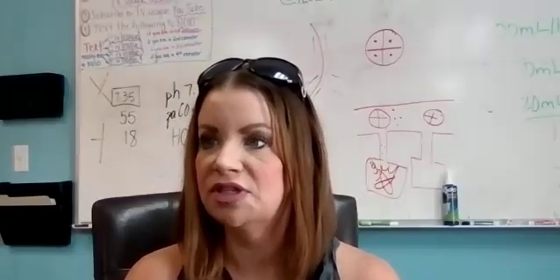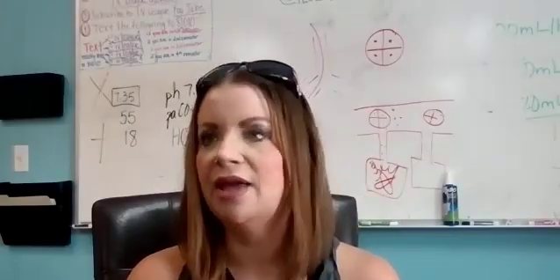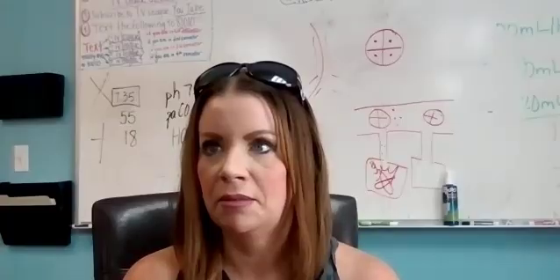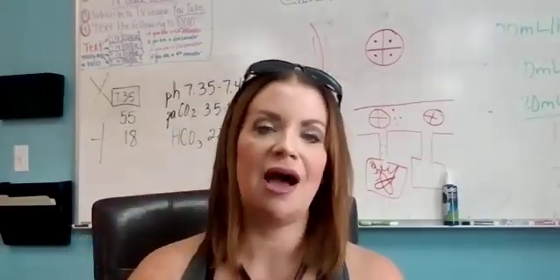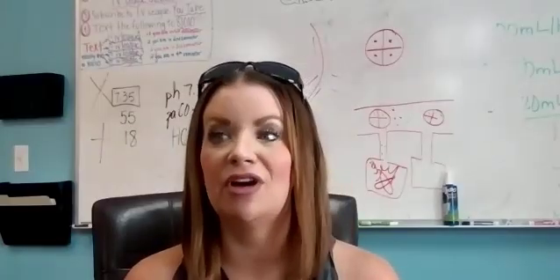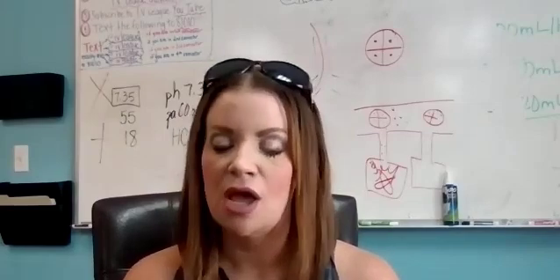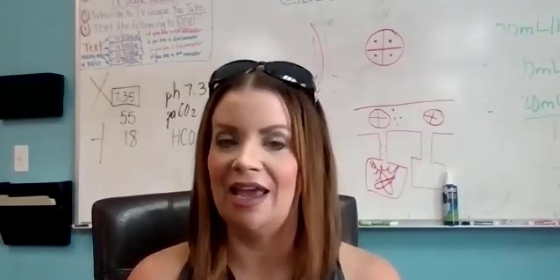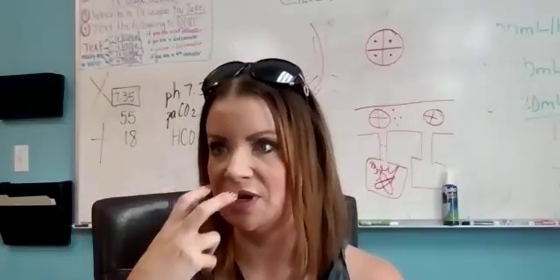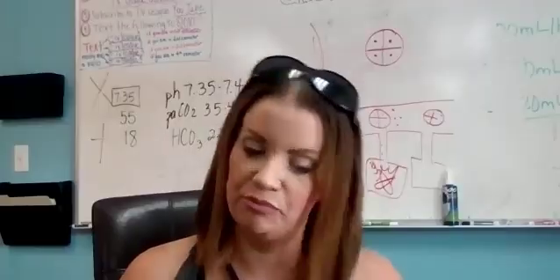You'll see this a lot in the ICU. Like a humidifier? Okay, so it is a high flow oxygen device. You can get a lot of oxygen at one time, a flow rate of up to 40 liters a minute. That's a lot, right? But the oxygen is heated and humidified, so it makes your respiratory system much more accepting of it. Because I know when you put a nasal cannula on, it's dry, and that can cause more inflammation and irritation.